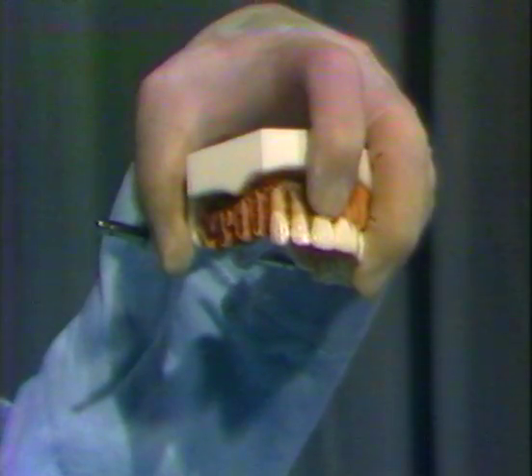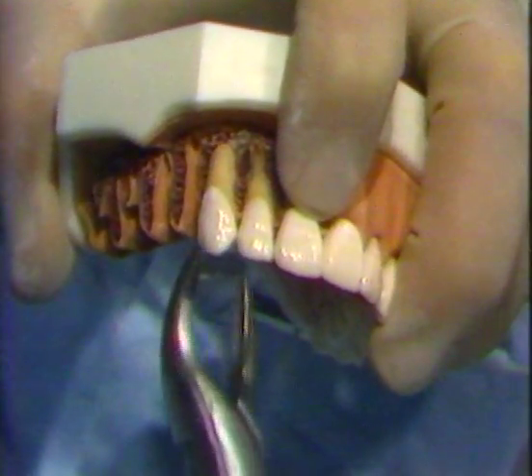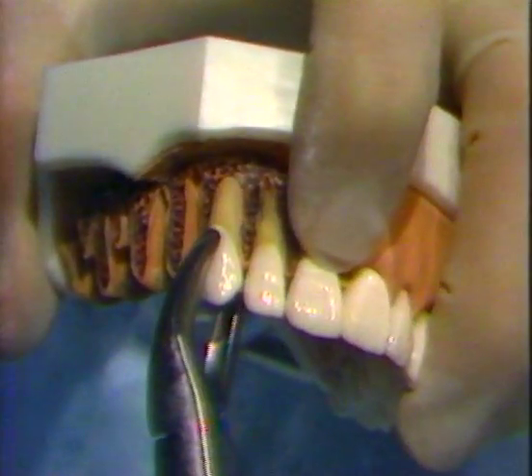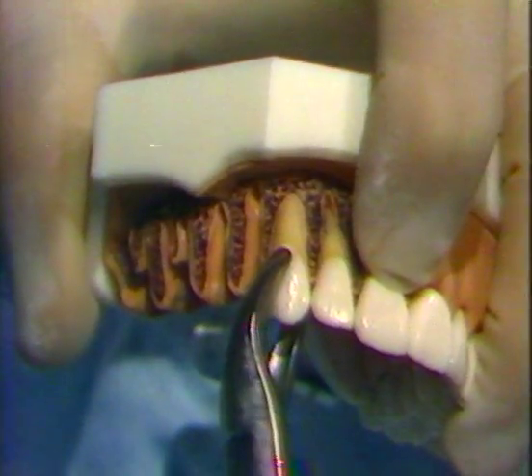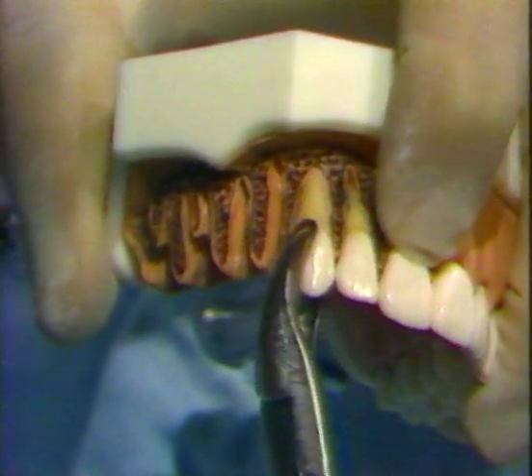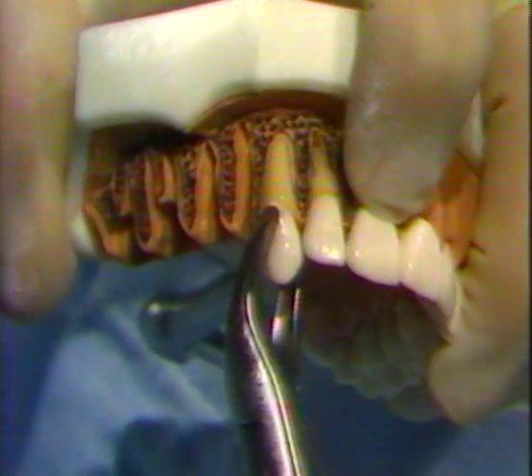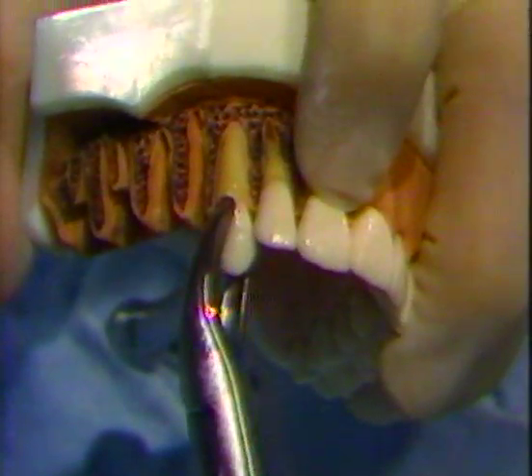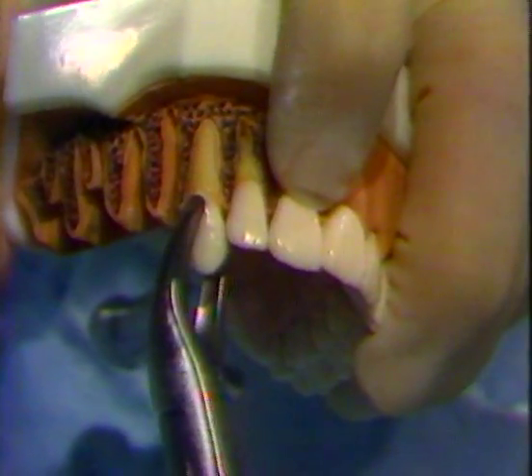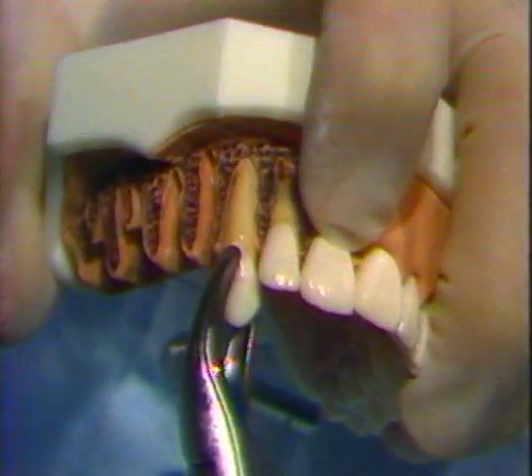The maxillary cuspid has a long, conical root. After the forceps have been properly seated and the tooth slightly pushed up into the socket, the first movement is to the labial side. This is followed by movement to the palatal side and mesio-distal rotation. Once again, movement to the labial, palatal, and then rotation repeated a little more vigorously. This is followed by downward movement in the long axis of the tooth.